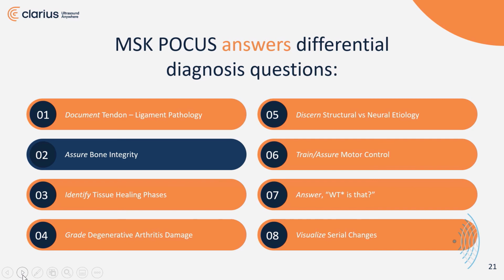We can take a look at the darkness associated with fluid weepage, and we can identify the healing phases that are developing within that bone repair. We can also see tough-to-find fractures, lesions that are actually stress fractures that take up to a week or two to be well identified on plain X-rays.